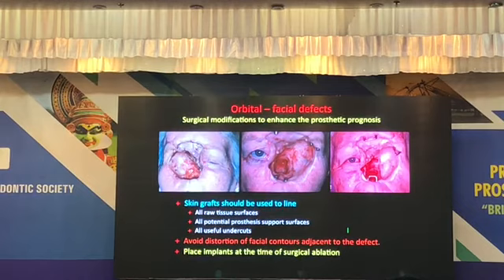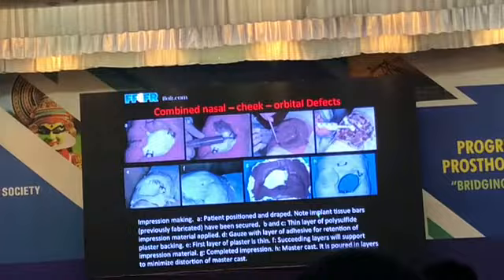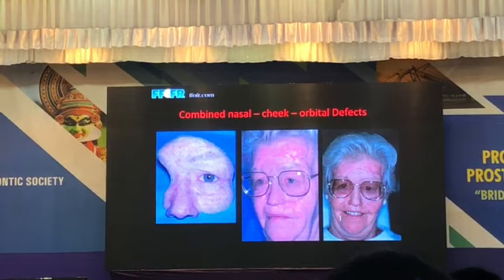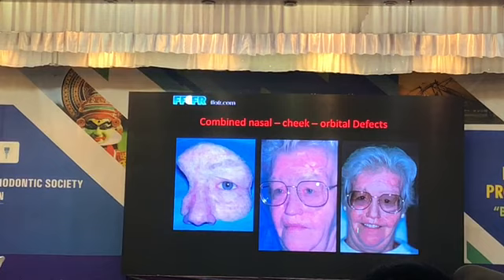And this is Dr. Romanas' patient. I've shown you here before. This is a patient of mine that I've done. And you can see the quality of the outcome. You do the same basic steps that you would do for any facial: make impressions, make wax ups, finish the appliance, and that's what you've got with implant retained appliances. So you're restoring these people's lives. They can wear these appliances. The retention is sufficient to keep the appliance in position.